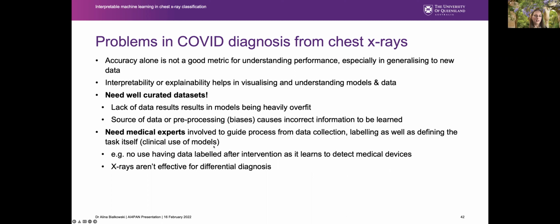Interestingly, we don't actually diagnose COVID from chest X-rays. And in fact, it's not able to perform a very effective differential diagnosis. For example, many people don't actually have any respiratory problems, but they still might have COVID. So we have to really think of the clinical use of these types of models as well.